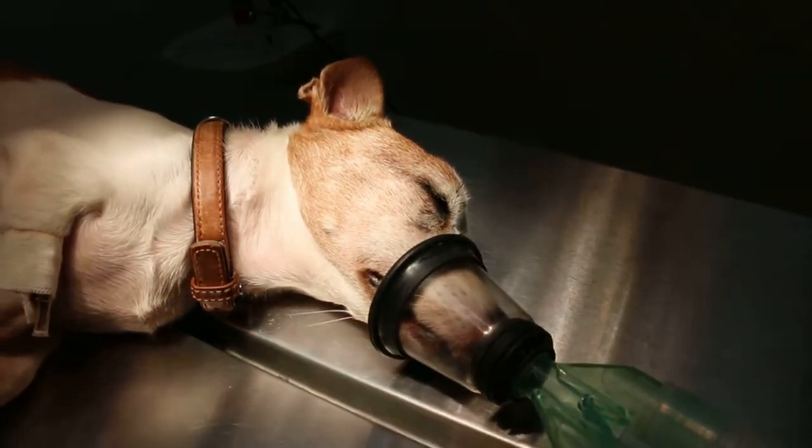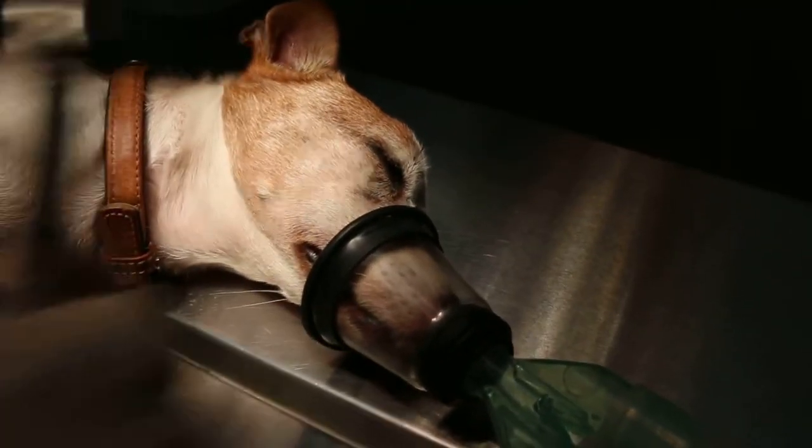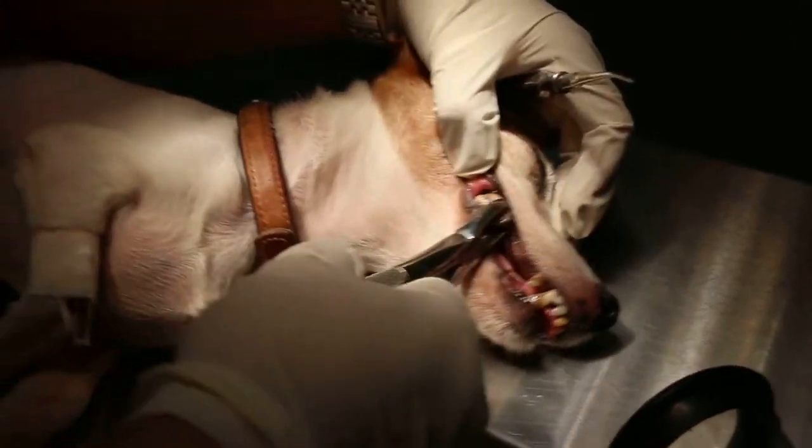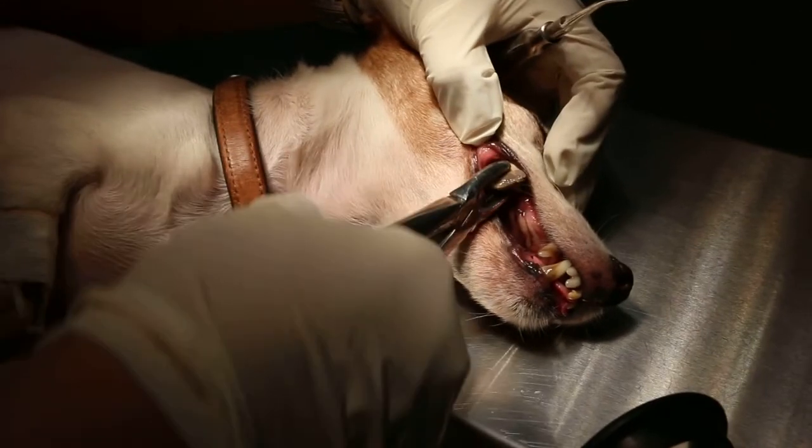September 4, 2014, the dog is under 5% isoflurane. Now we check the carnassial tooth, which is pretty bad.